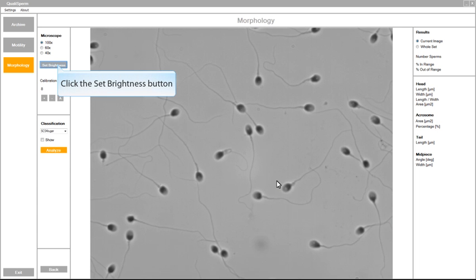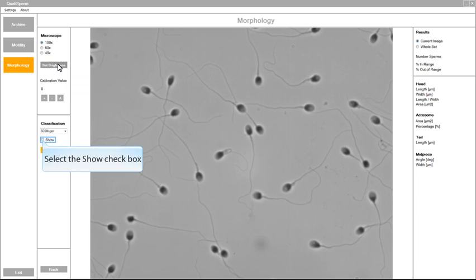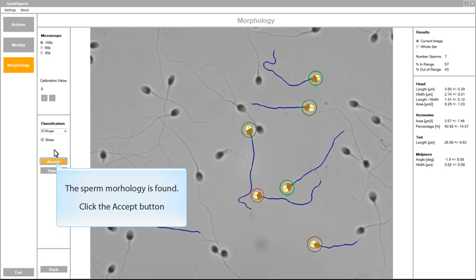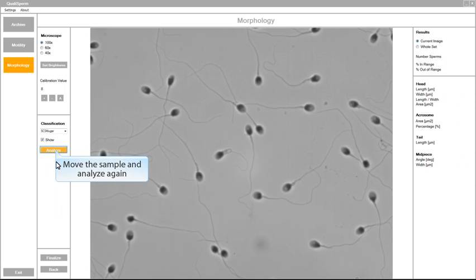After optimal brightness and contrast are automatically set, click Analyze to capture the sperms in the field of view. All sperms which correspond to the WHO guidelines are lighted on the screen.